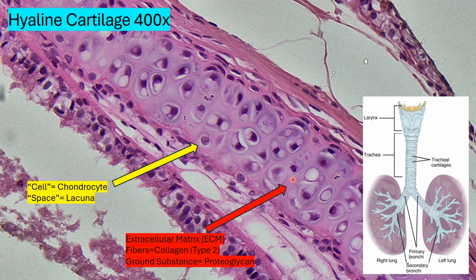The extracellular matrix is comprised of proteoglycans and has this gel-like consistency to it and is glassy in appearance. Now, note that it does have collagen fibers within it, although they're not easy to see and require different techniques to visualize them. Here we see the perichondrium, peri meaning around, or it surrounds the cartilage. This is actually dense, irregular connective tissue.